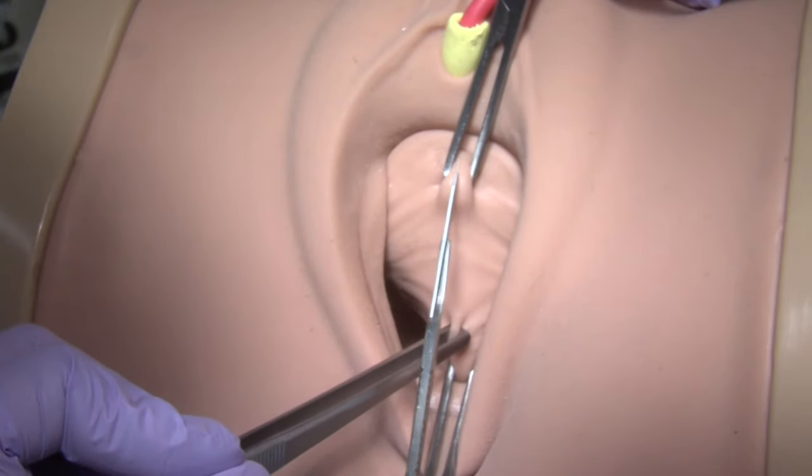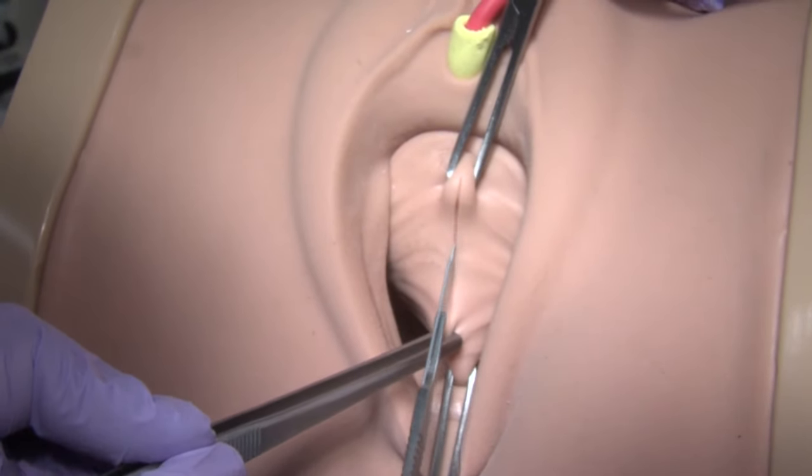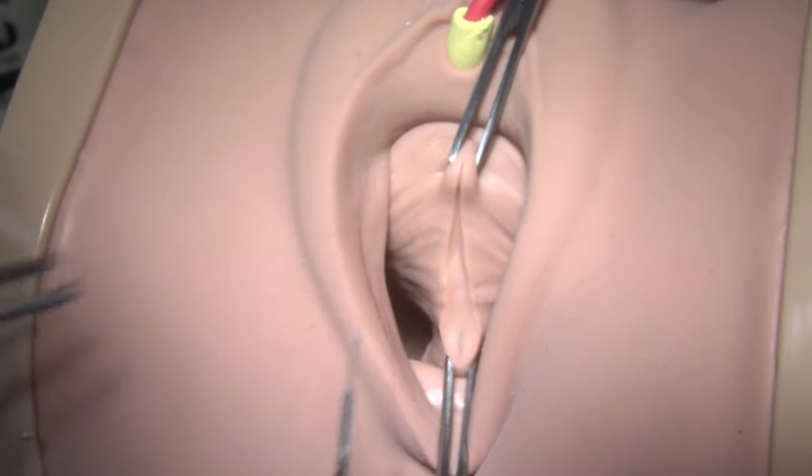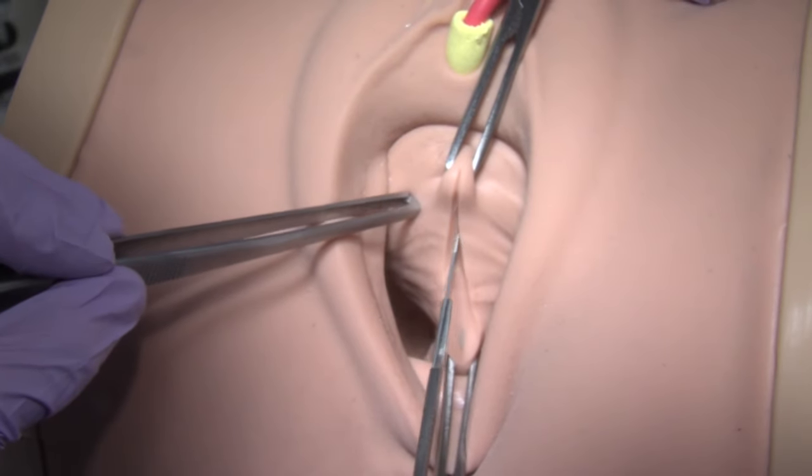With a scalpel, incise the vaginal epithelium between the two Alice clamps, from the urethro-vesicle junction to the apex.